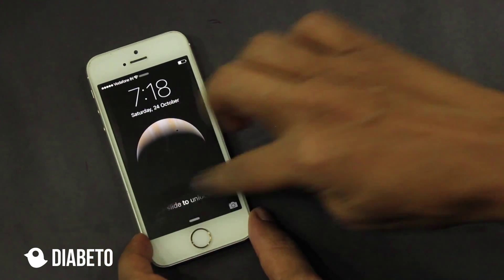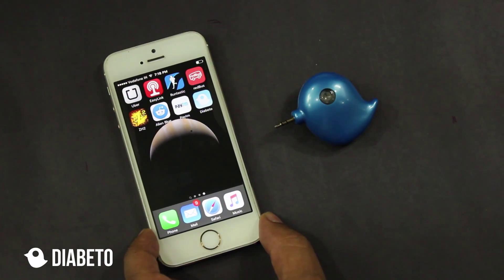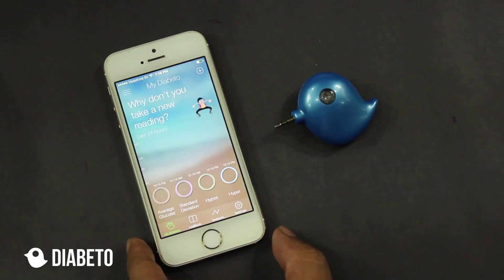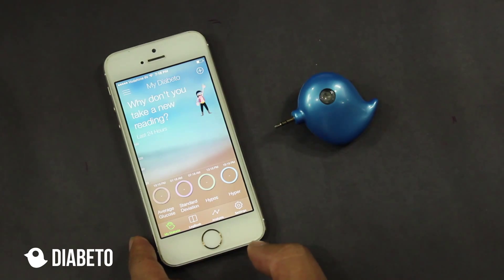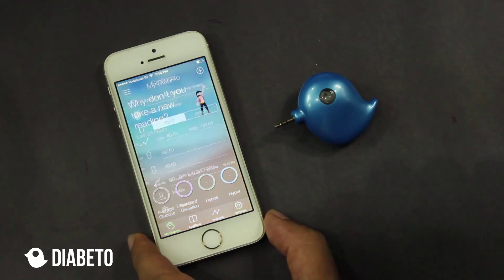If you are a beta tester, you should be getting an invite from Hockey app. You can download the iOS application from the Hockey app. Once you have downloaded, you will see the pretty home screen. Now since I have to set up the application, I will go to the settings screen.